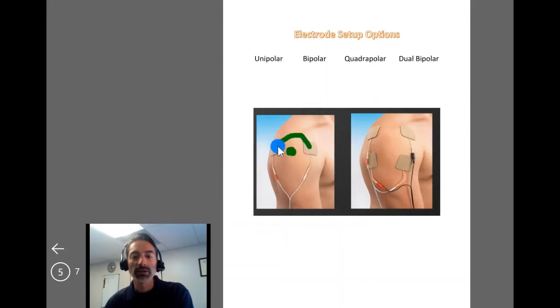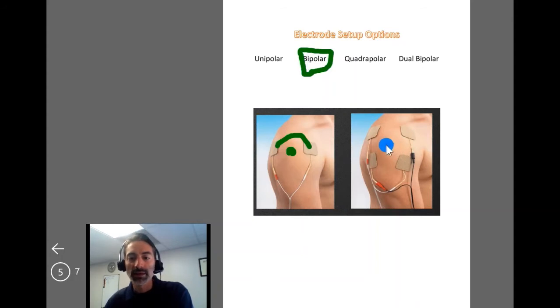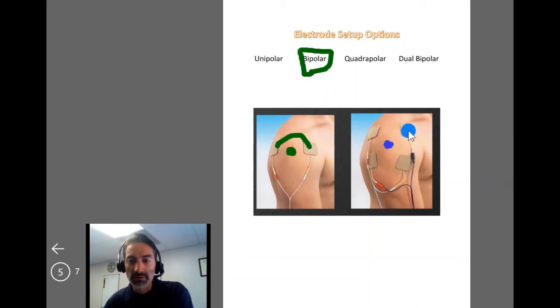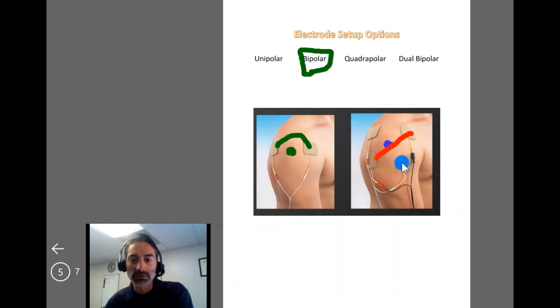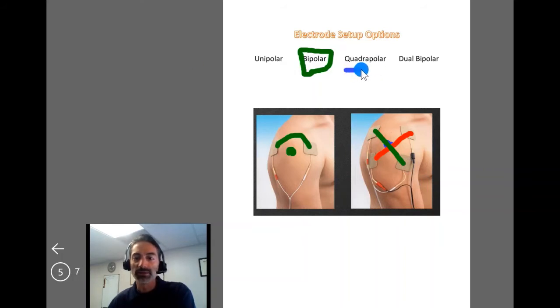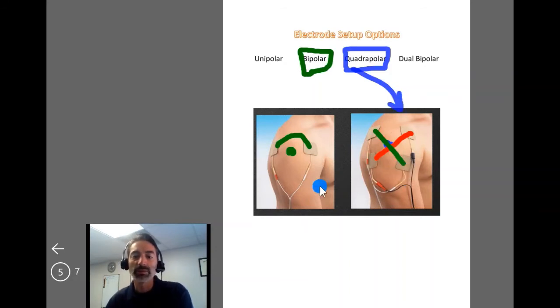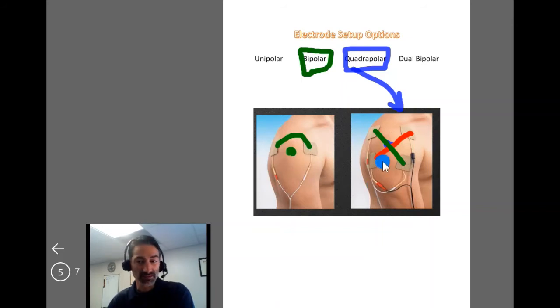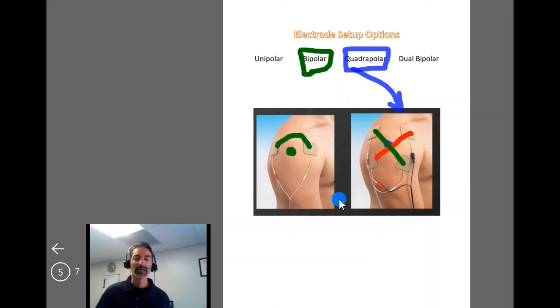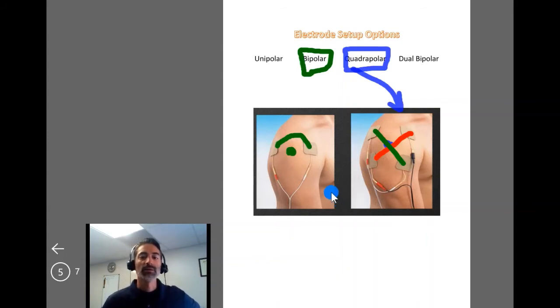For shoulder pain, going from channel one to channel two in a single channel is a bipolar setup. If instead you have channel one going one direction and channel two crossing it with four electrodes total, that would be a quadrupolar setup — more like an IFC setup. Neither of these really looks like a Russian or NMES setup if you're trying to target motor points and achieve muscular recruitment.